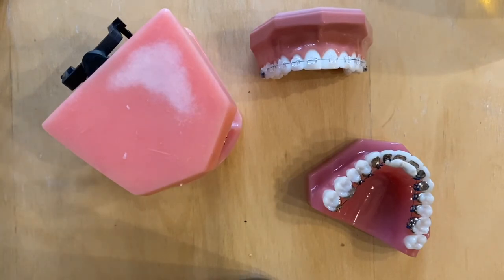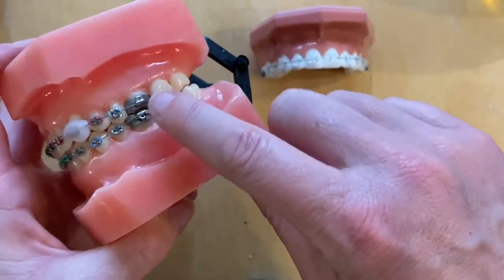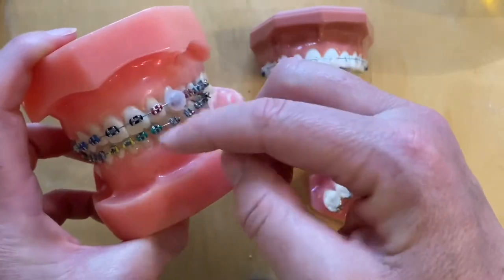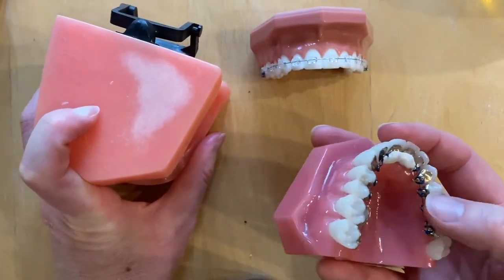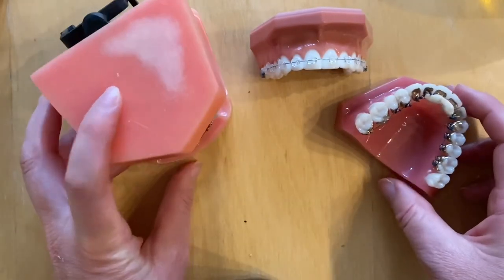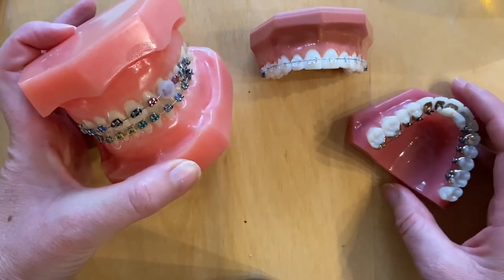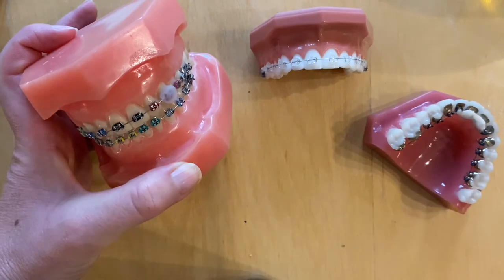If you have any problems with your braces, get back in touch with the practice. It might be that the wire is sticking out at the back as the teeth straighten, or that a bracket has detached from the tooth and is jiggling on the wire. If a bracket from a lingual brace comes loose, these are customised for every patient and every tooth, so it's important to try and keep hold of it so we can re-stick it. If you have any problems, come and see us and we'll get it fixed. Otherwise, we'll see you in about eight weeks after fitting.